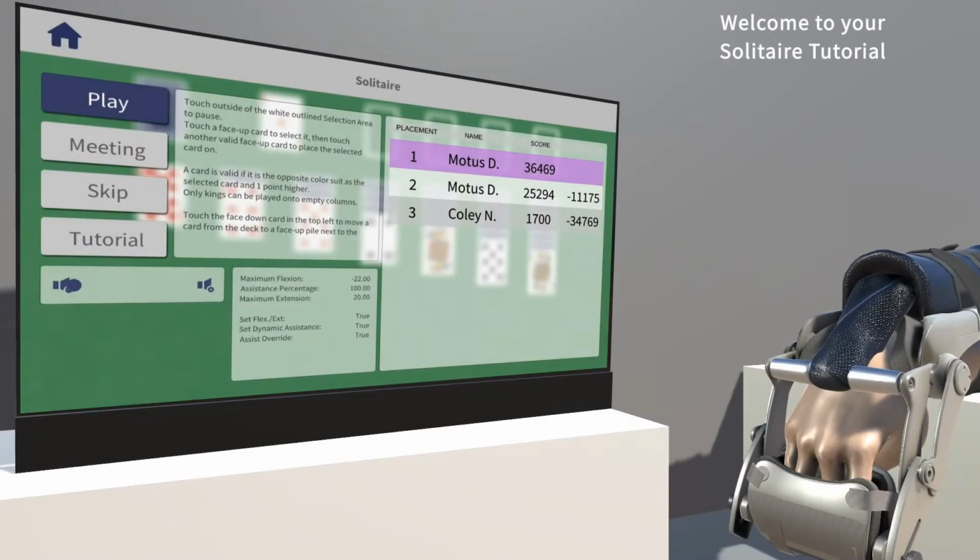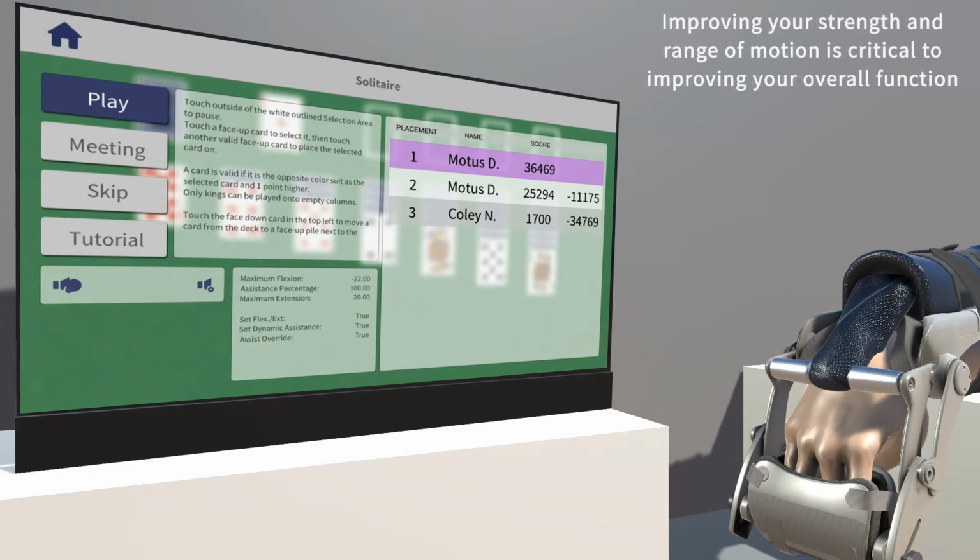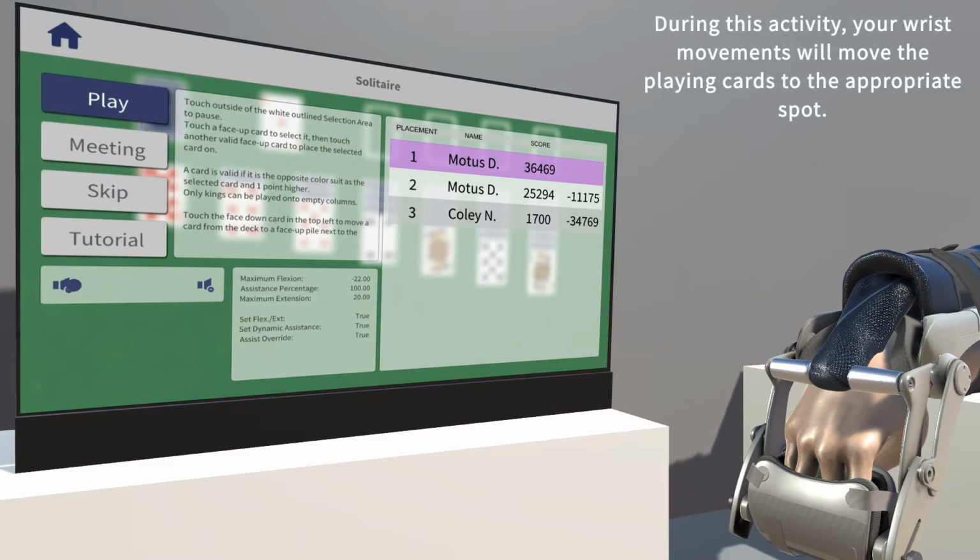The therapeutic goal of this activity is to work on improving the strength and range of motion of your wrist and hand. Improving your strength and range of motion is critical to improving your overall function. During this activity, your wrist movements will move the playing cards to the appropriate spot.